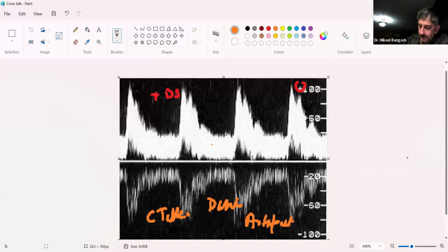Okay, guys. But please remember that in your B mode imaging, what do we need for a mirror image? You will need a mirror. And what do you get as a result of that? You get the artifact called a mirror image. Where is that going to be? Deeper to the mirror, which is going to be a strong reflector.